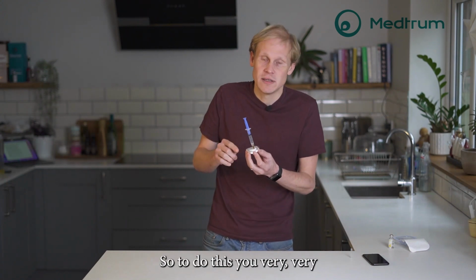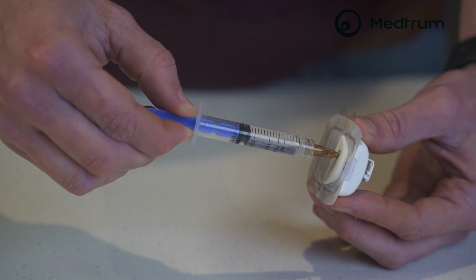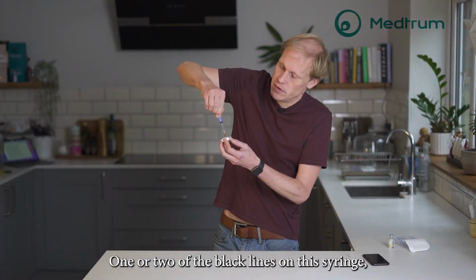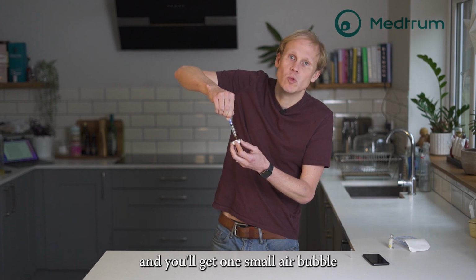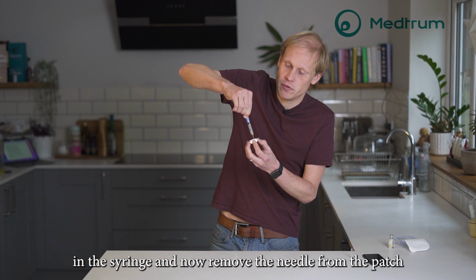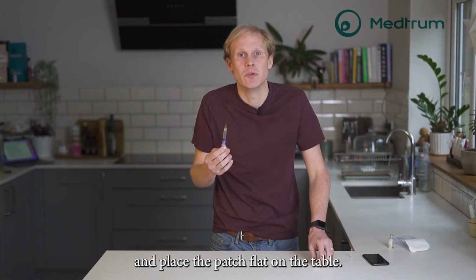So to do this, you very, very gently pull back on the plunger, 1 or 2 of the black lines on the syringe, and you'll get one small air bubble in the syringe. And now remove the needle from the patch and place the patch flat on the table.